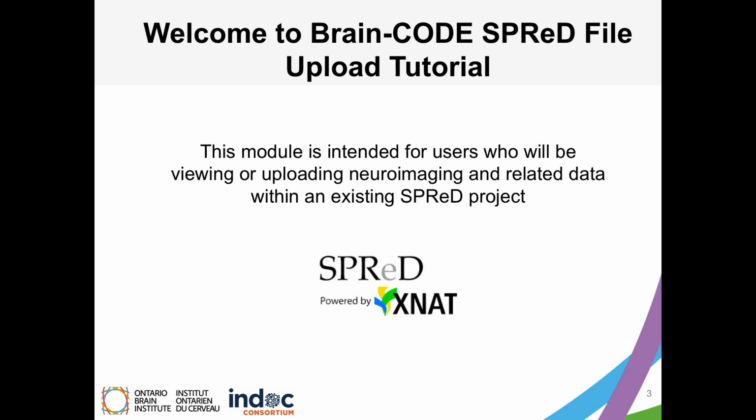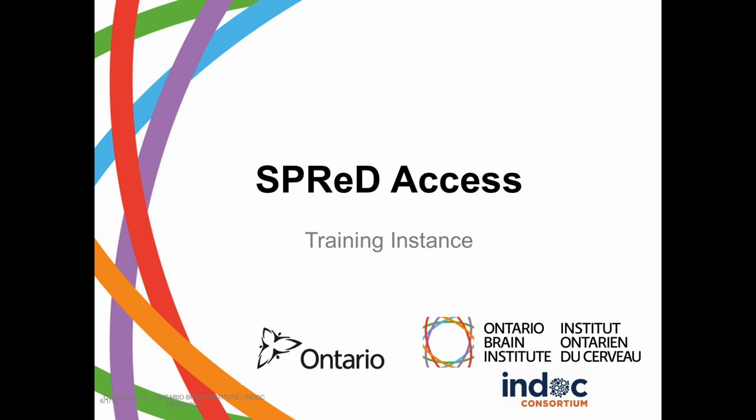Welcome to the BrainCode SPReD file upload tutorial. This module is intended for users who will be viewing or uploading neuroimaging and related data within an existing SPReD project. SPReD Access Training Instance.